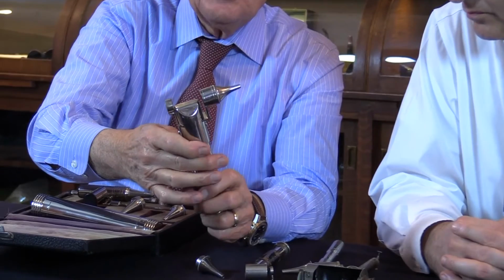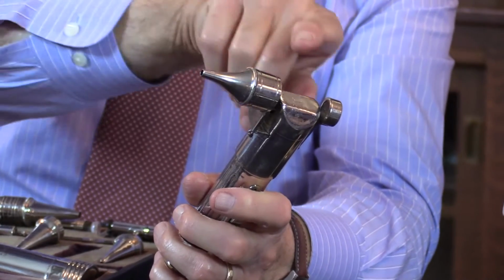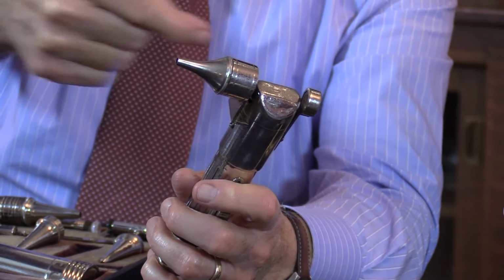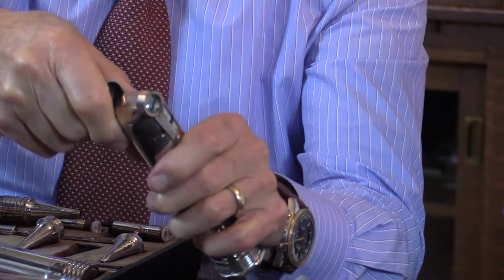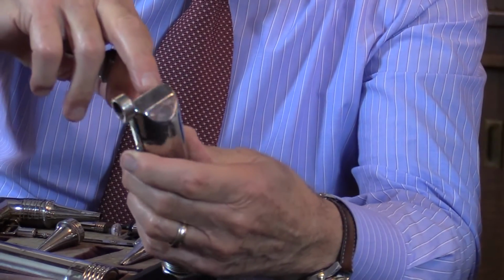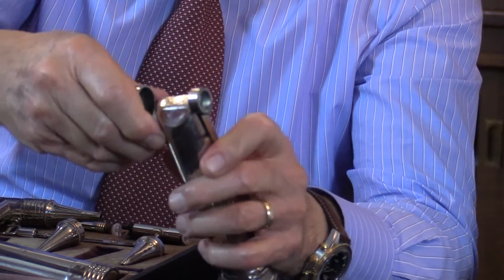I think that's why they make it half a mirror, so you have more space for instrumentation. These are just quickly some of the old versions of the otoscope. This is one of the oldest otoscopes, after the lighter version. The thing about this, and we'll be talking about it later on, is the axis of the light beam. This is not the same axis as the center of the speculum, but that's the best you could do. The light bulb here was just a regular light bulb, nothing fancy about it, and then you introduce this here.